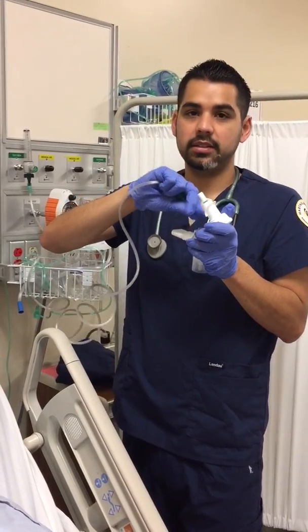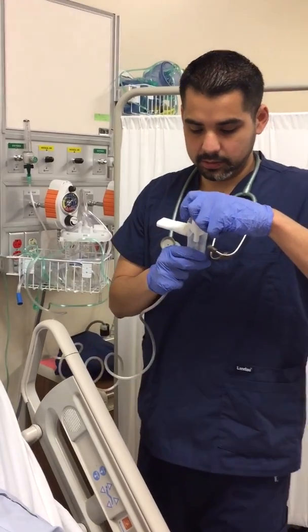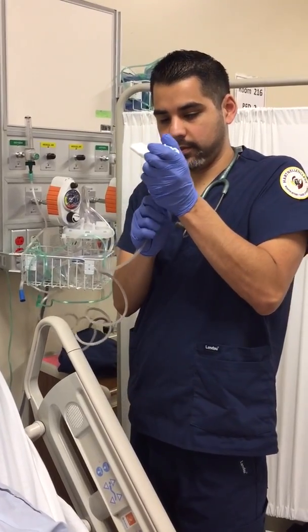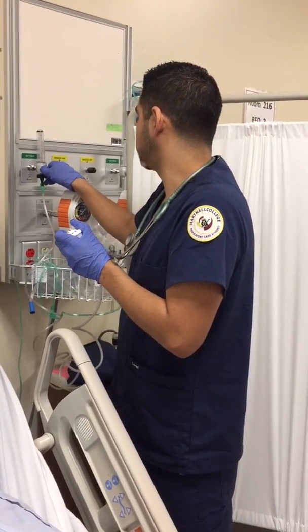Okay, so what I'll do is I'll open this up, and I'll get my medication, and I'll pour it inside. I'll squeeze all of it in there. Then I'll close it up like that. I'll put this in. And the flow rate for this is 4 to 6 liters a minute. So then I'll turn up the flow.